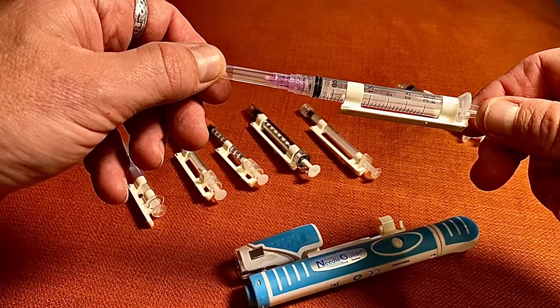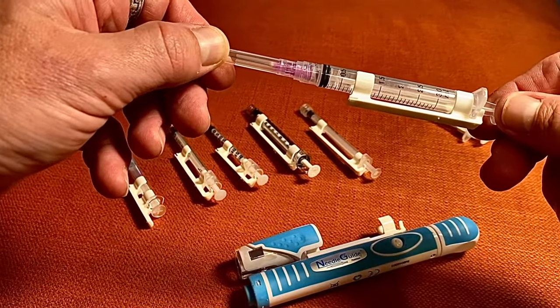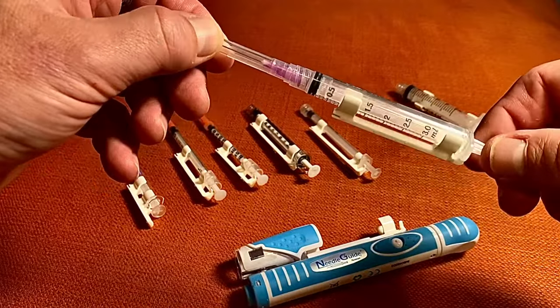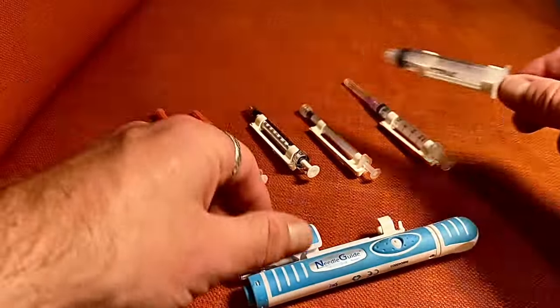For a lot of HRT or hormone replacement therapy testosterone patients, for some reason they're still being given these big three mil syringes. This is a syringe holder that we still include with the auto injector, and then all the way up to this big five mil as well.